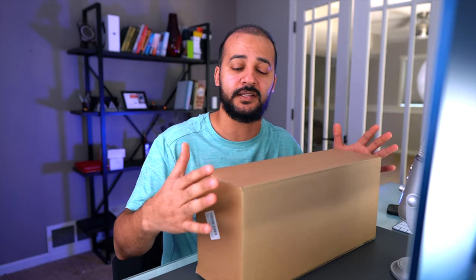Hey guys, thanks for joining me today. I got something for my personal use which is the Orthman knee support. This is basically how the box looks like, and we're going to open this box and see what's inside.